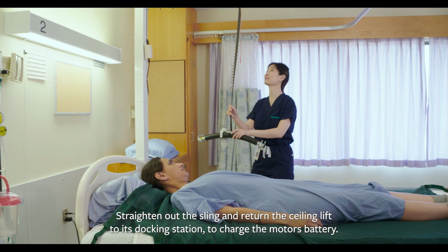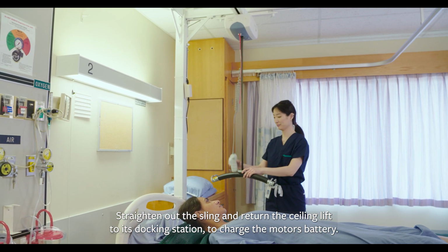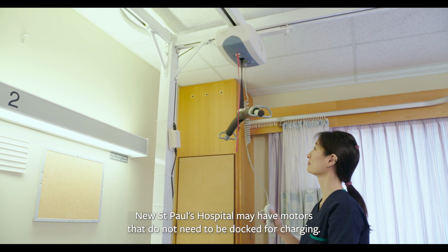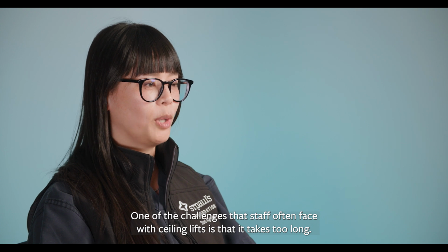Straighten out the sling and return the ceiling lift to its docking station to charge the motor's battery. New St. Paul's Hospital may have motors that do not need to be docked for charging. One of the challenges that staff often face with ceiling lifts is that it takes too long.